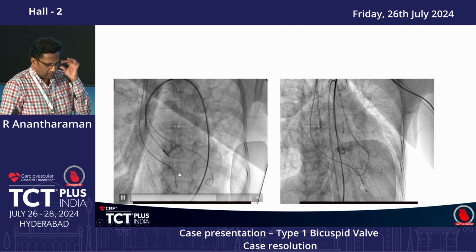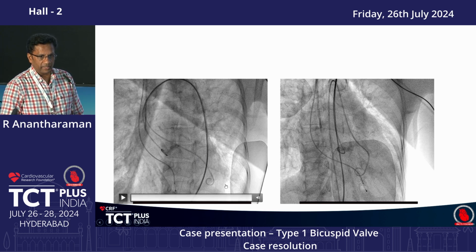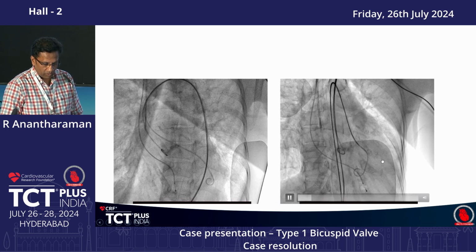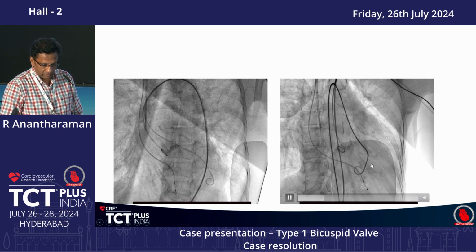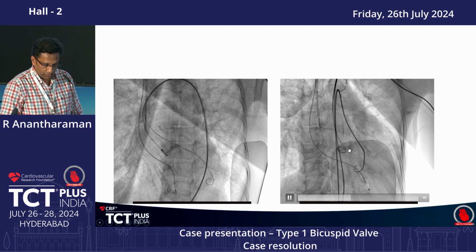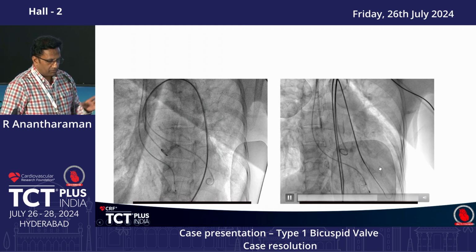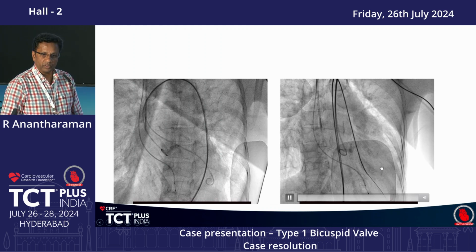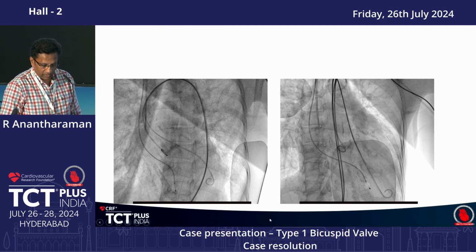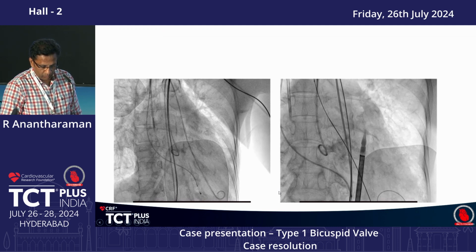Now this left-hand panel, the pigtail orientation and position is not something you should accept in a bicuspid, especially after having the wire. So you see on the right-hand panel what I'm doing, I'm taking the wire in, I will bring it back to the LVOT and get it down into the orientation where it is closer to the other pigtail and also facing towards the apex. If you accept the other position and take a self-expanding valve in that position, it will not cross. You will never cross in that position. So make sure that the wire position is as it is in the right-hand panel, and get into a good wire position here now.